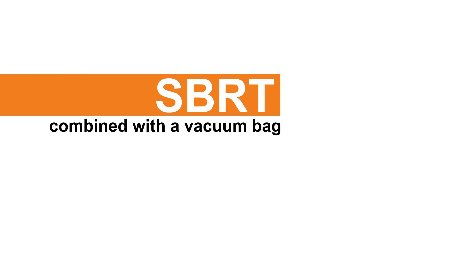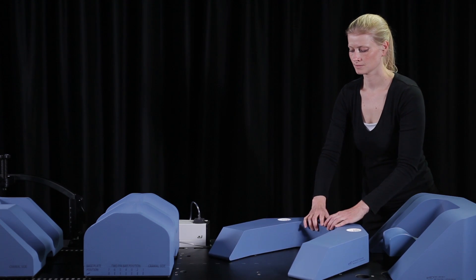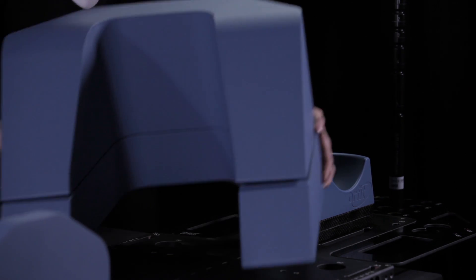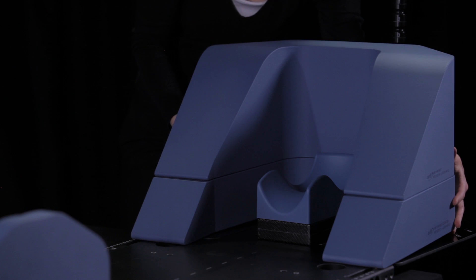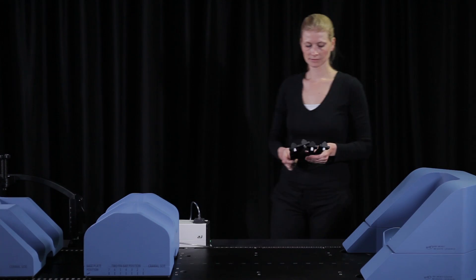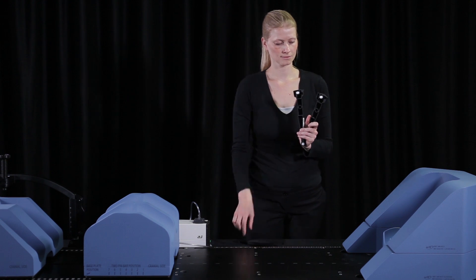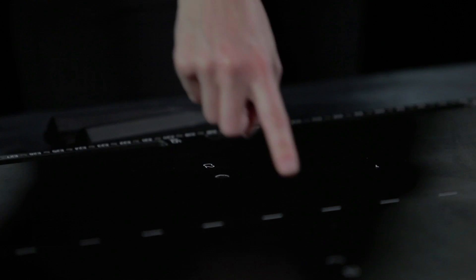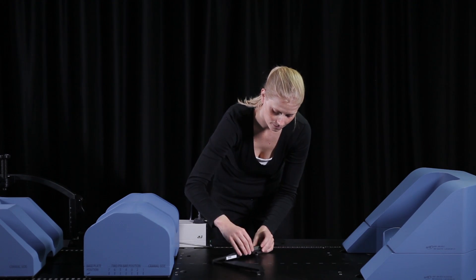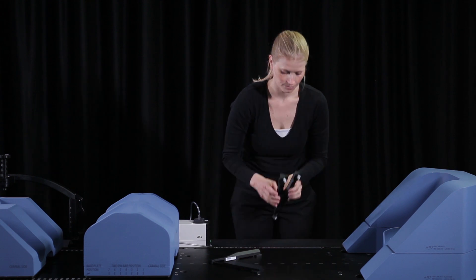The SBRT solution can be combined with a vacuum bag. You'll most likely need to use the armrest elevation cushion in combination with the armrest cushion, as the vacuum bag elevates the body. To make sure that the vacuum bag is positioned in a reproducible way, you should use two indexing bars. Position the indexing bars in one of the possible locations on the baseplate.